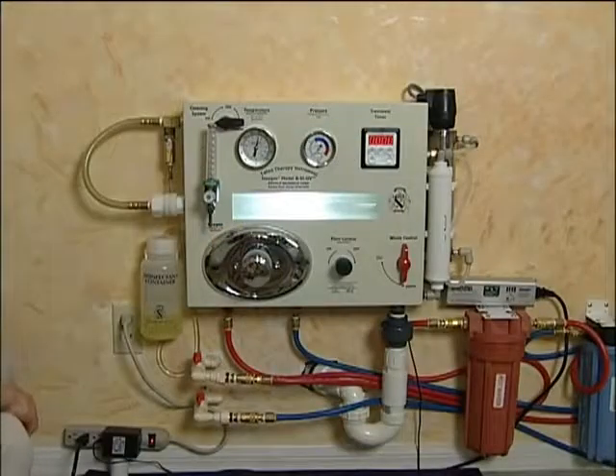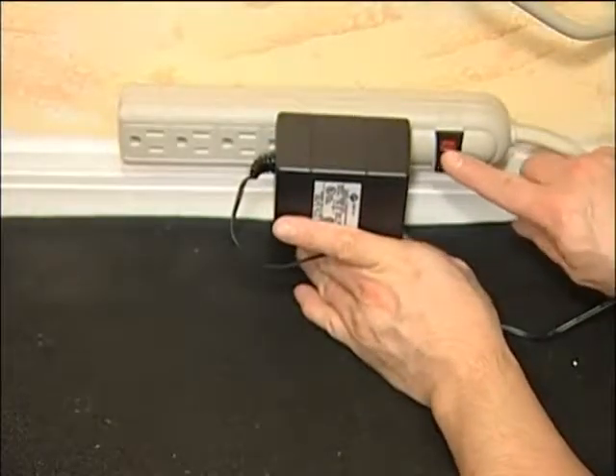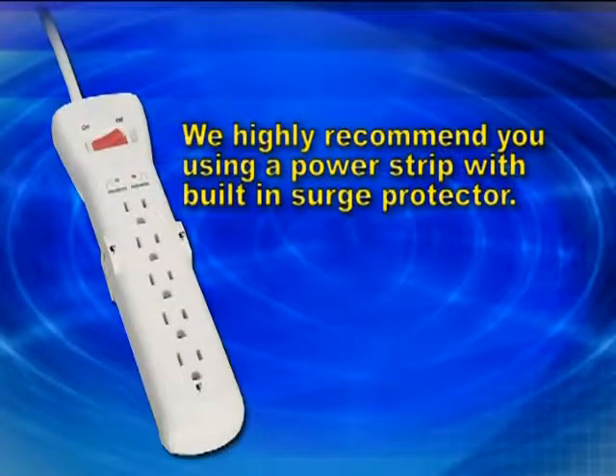The instrument is equipped with a 12-volt viewing light. A transformer is connected to a jack on the bottom of the unit and then plugged into a receptacle. We highly recommend that you use a power strip with a built-in surge protector — this will provide an easy way to turn your unit on and off and also protect your instrument from power surges.